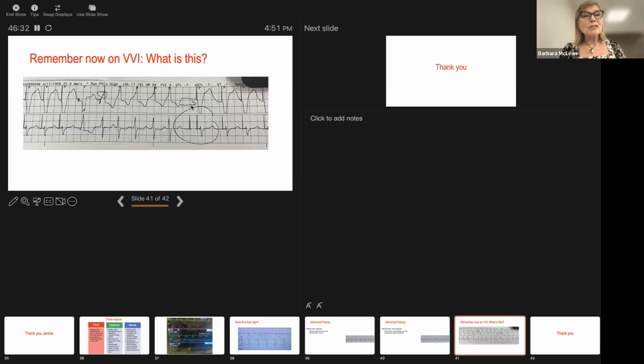Yesterday, this is what we're seeing when we're looking at our patient. What the heck is this? This is the adventure in pacing that I'm talking about. Here's your spike, here's your capture, here's your spike, here's your capture, here's your spike, here's your capture. Now, this might be a little spike here, I'm not certain. And there may be a spike here. I think you actually have fused your patient's own beat with the pacing spike.